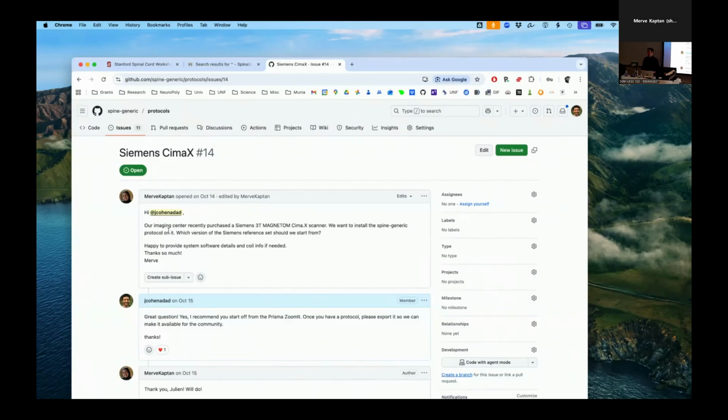Yeah, and during the panel discussion, we'll have Hugo Decker here, a neuroradiologist, and he's involved in choosing what protocols make it into at least Stanford hospitals, so he can probably answer some of your questions on that. Typically, here you're going to get a T2 and T1 sagittal series, and an axial series. They typically get the multi-echo gradient echo, or MEGRE, sequence as well, with or without gadolinium contrast.